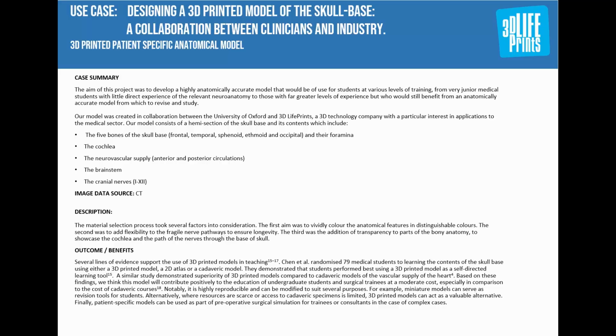So we've embarked on a series of models with them, and I'll show you one of these models at the minute, which is the base of skull, to enhance the current curriculum and enhance the cadaveric teaching with lifelike models of the anatomy taken from live anatomy, not taken from cadavers, which show the actual anatomy of these structures, which degrade quickly in cadavers. So that was a little bit of a summary about this model.